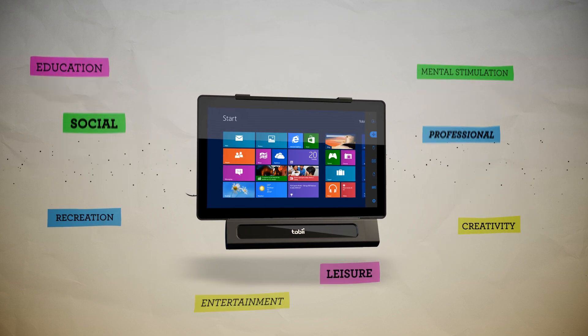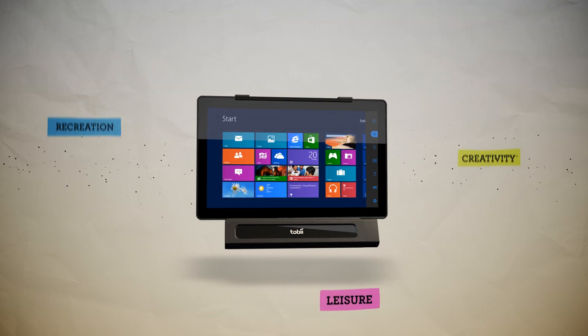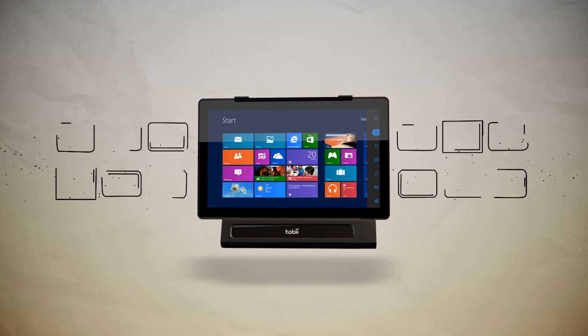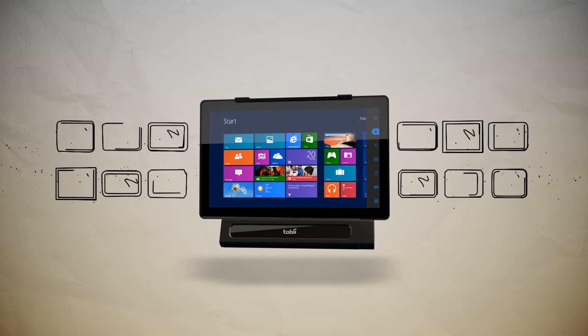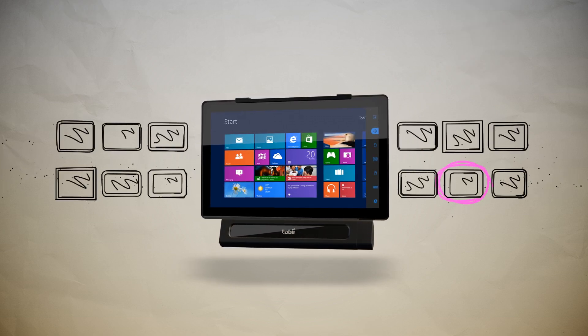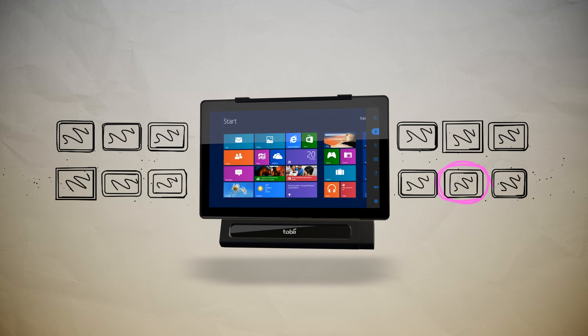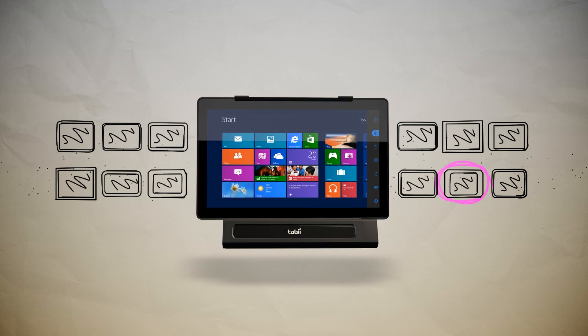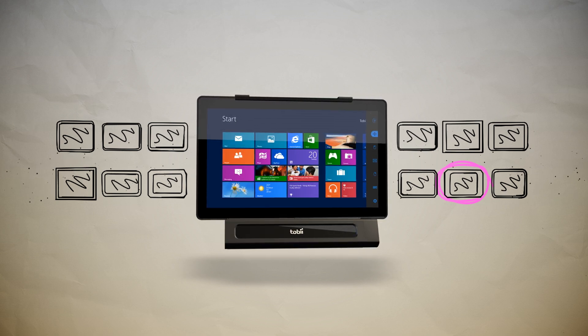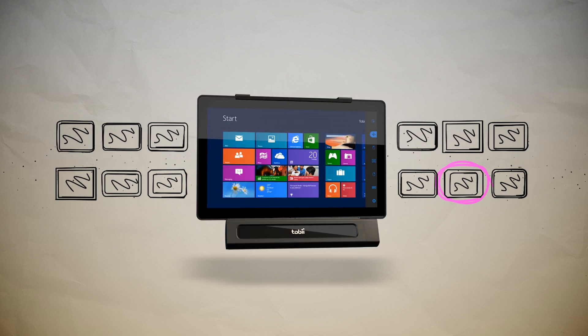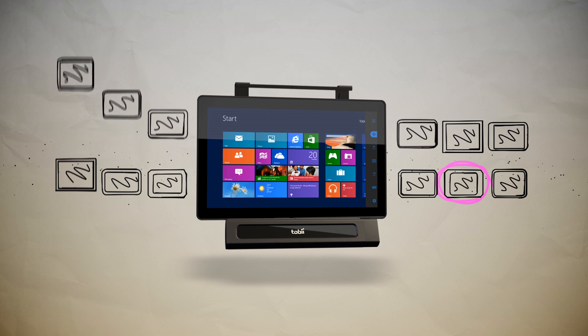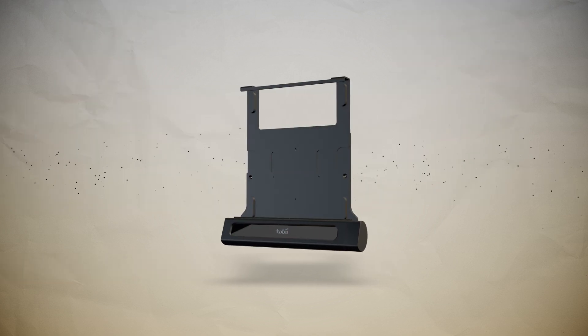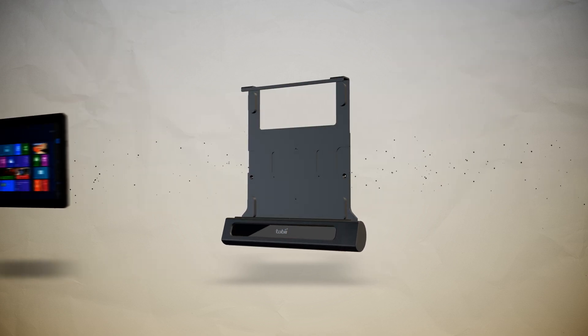The iMobile bracket can be used with nearly any Windows 8 Pro tablet, giving you the freedom to select one that best suits your needs and budget. This also makes it easier to keep up to date with technological developments. Simply replace the tablet when it becomes outdated.